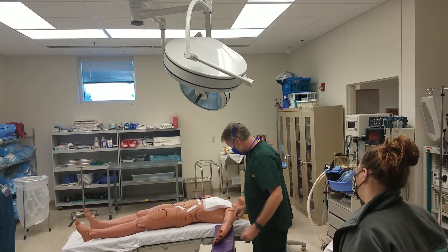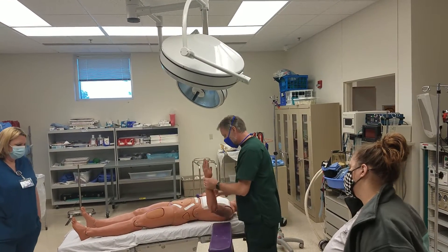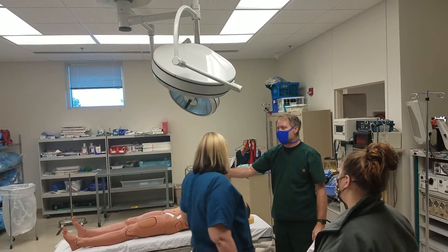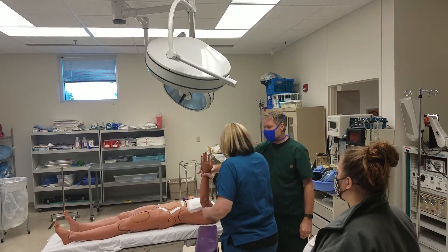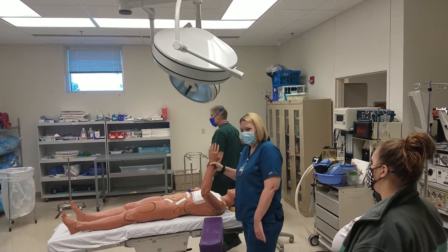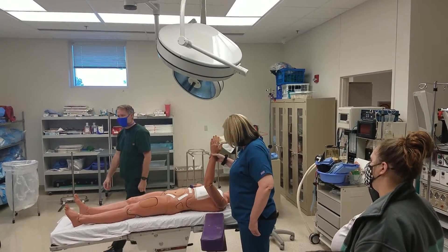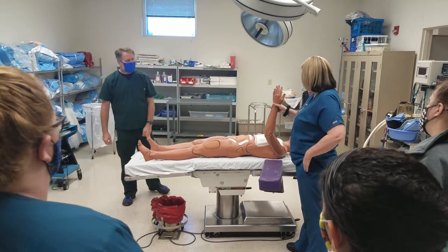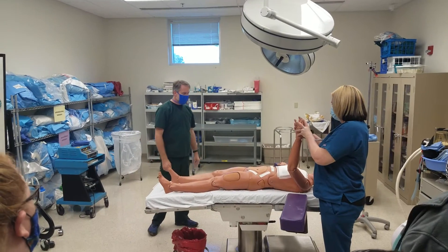So the arm's been prepped. Let's assume that it has been. Somebody's got to hold the arm up — somebody's sitting there holding that arm. Who's doing that? The circulator. The arm that they're holding — should we hold it with sterile gloves? Yes. So that's all well and good. So let's create our sterile field.